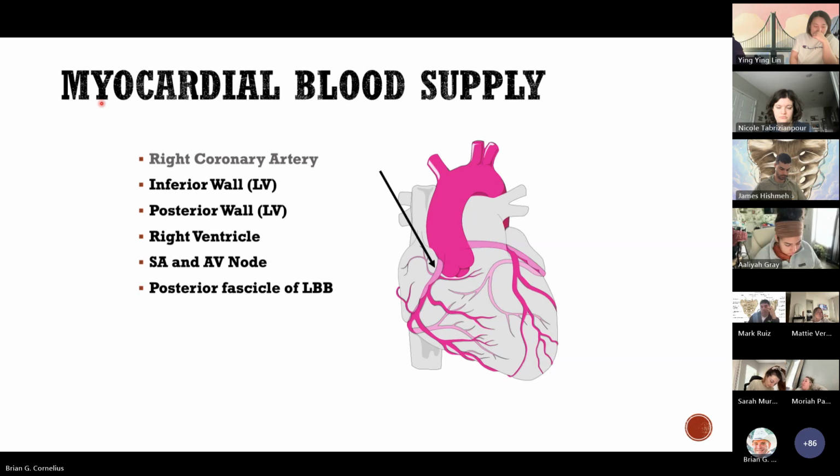So it's important for us to know how to take the data from a 12 lead and apply it to a patient's heart. So there's a wide variety of cardiac structures that perfuse the heart. I'm just going to kind of go through them step by step and talk about the artery itself and then what portions of the heart it supplies. And then we'll get into ST elevation and interpreting 12 leads and stuff in just a second.